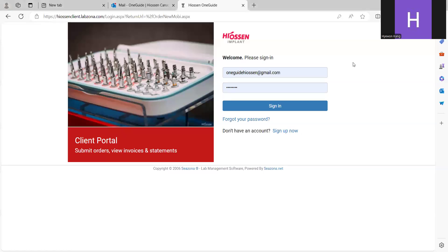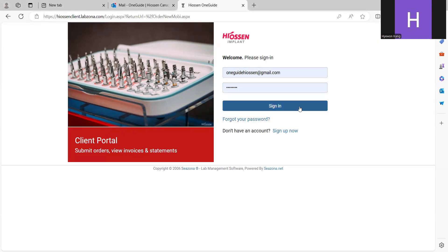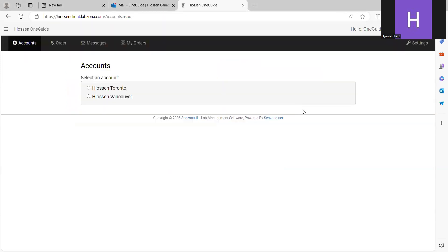Hello, I want to show you how to submit the case. This is the login page when you first go into the client's portal site. Put the email and then password. Sign in.